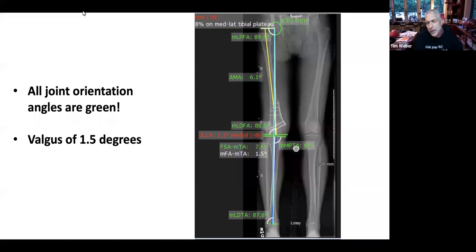Yeah, but my question is, to what extent should we be basing our decisions for osteotomy or not osteotomy on using the arthroscopy? Because in the past, it never really was part of the decision-making process. And when you go back to your standing alignment view, the joint surface looks reasonable.